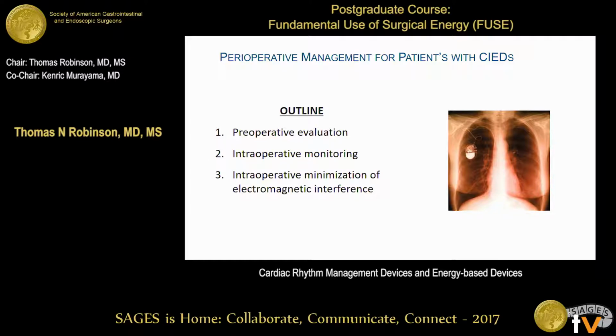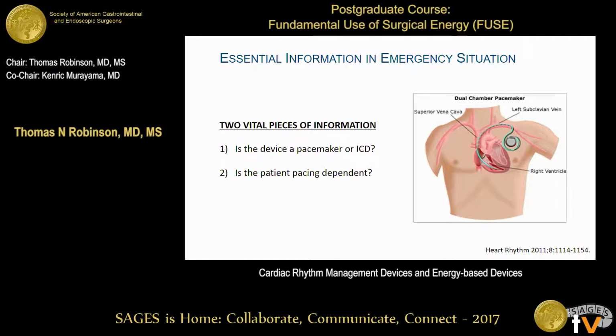I'm going to do just two slides on intraoperative monitoring, because the FUSE test really has a bunch of questions on that, and so we might as well get those questions right. And then finally, when you're actually in the operating room, we're going to go over how you can minimize the interference that you're creating on that implantable cardiac device. All right, so here we go.